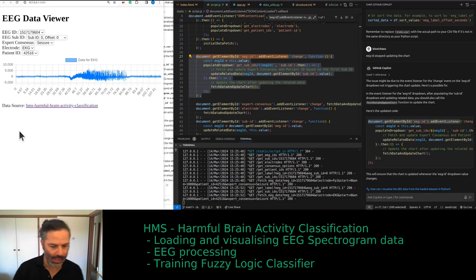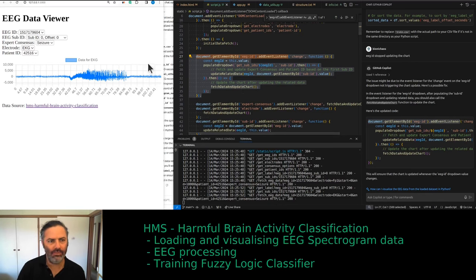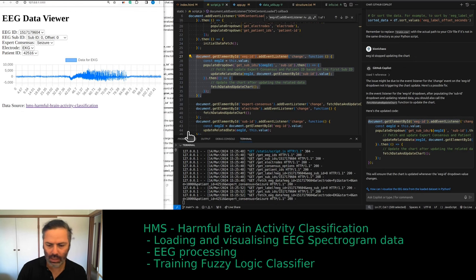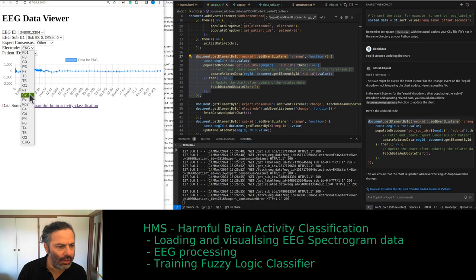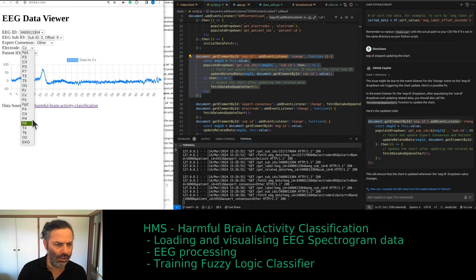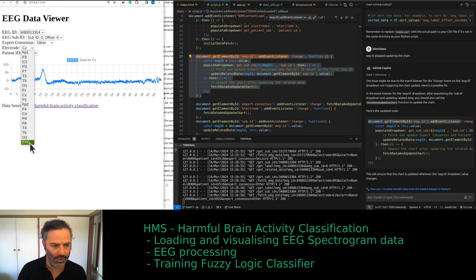Using the same dataset from Kaggle — there's a link at the bottom of the page. Eventually this tool will be available for you to play with. You can select your EEG ID and select the channel. It has a standard EEG montage with one ECG channel.